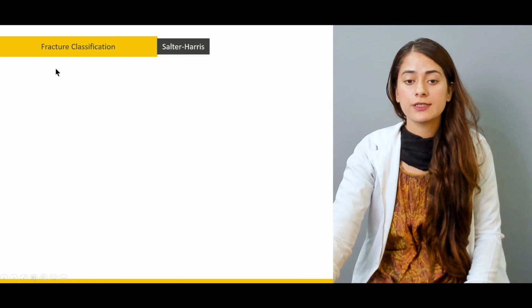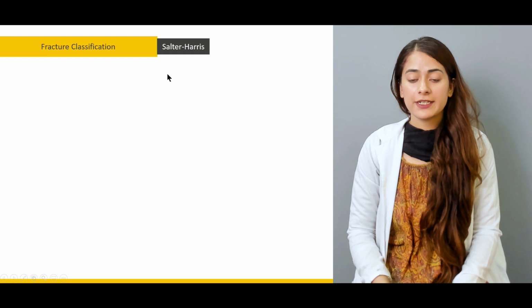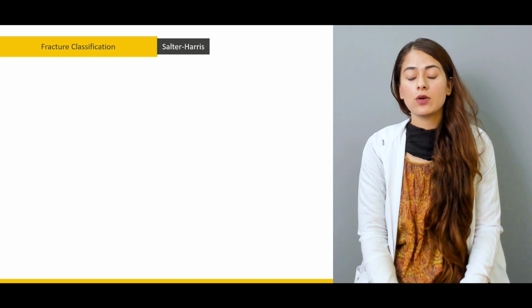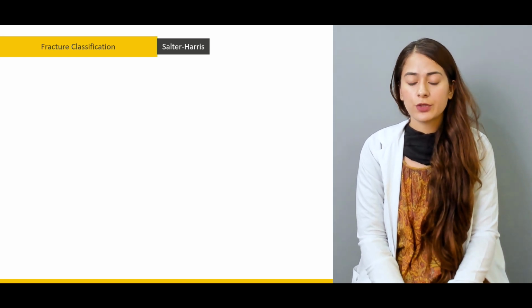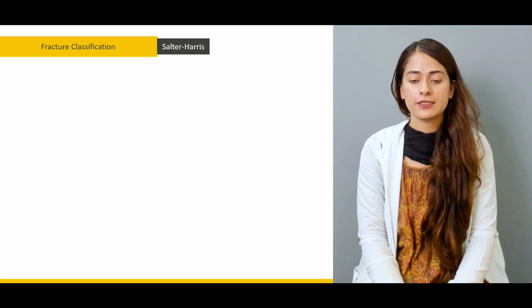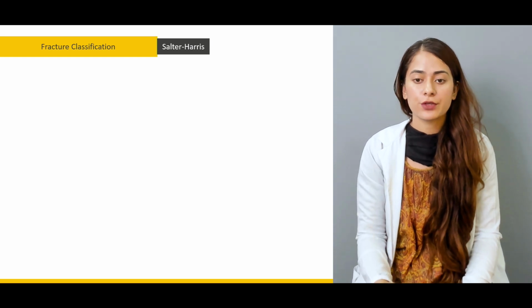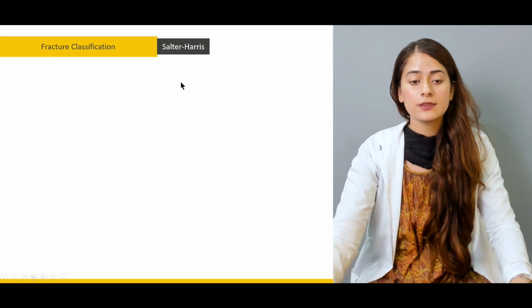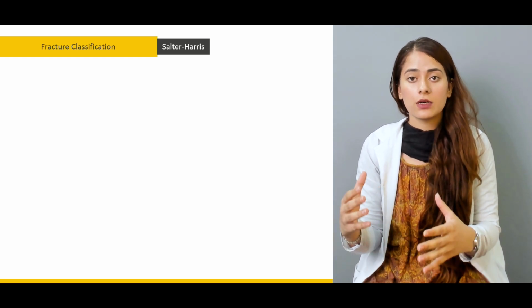Now we move towards the fracture classification. So fractures can be classified, like I said in the introductory section, on numerous bases. But here we're going to talk about the Salter-Harris classification, which is a classification for young children and their fractures. So what happens, obviously there are differences in an adult bone and the bones of young babies or some young children.